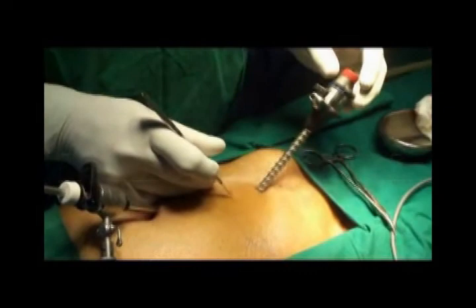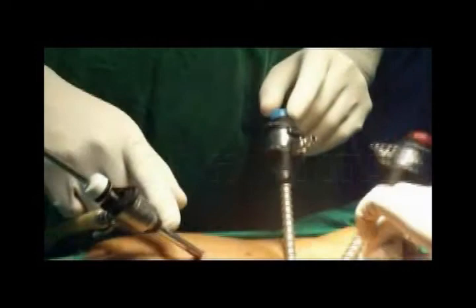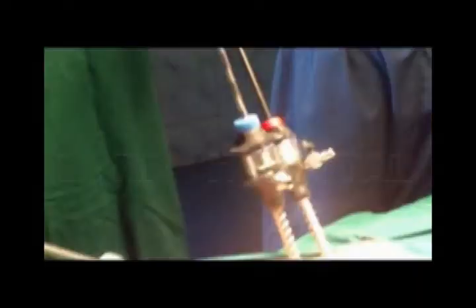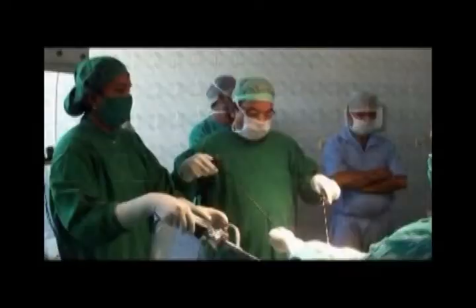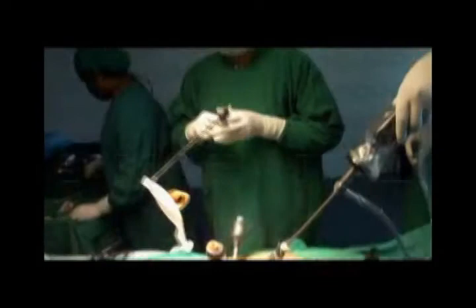That's the suprapubic port — a 5 mm port again — then you have the middle port. The lower two ports are the operating ports. Here I am using an old round rod-like instrument; we used to use this in the past as a liver retractor, and it is being used for dissection with very little trauma. The dissection is now complete, and you are ready to introduce the mesh.